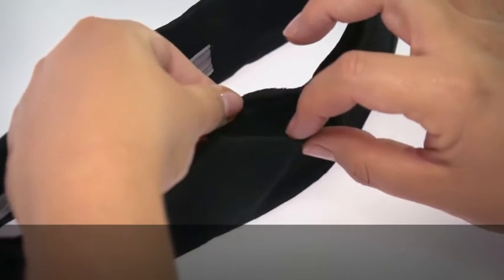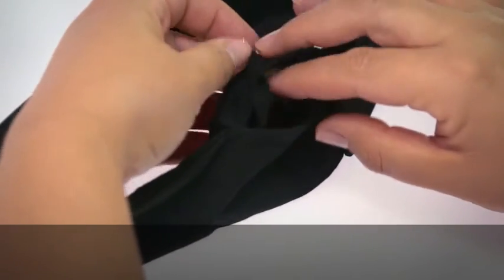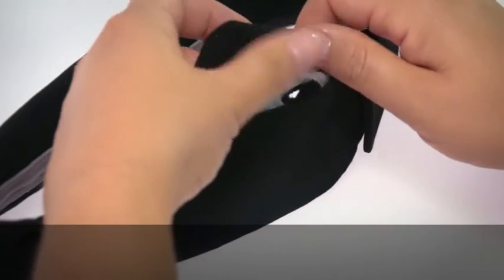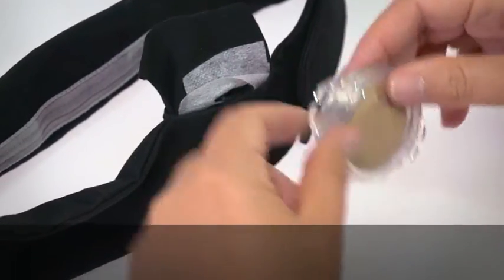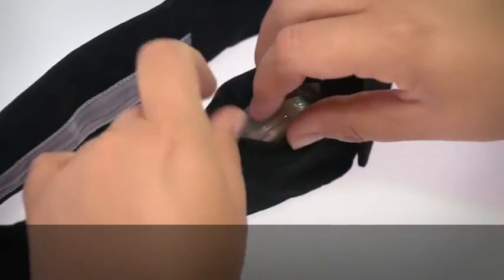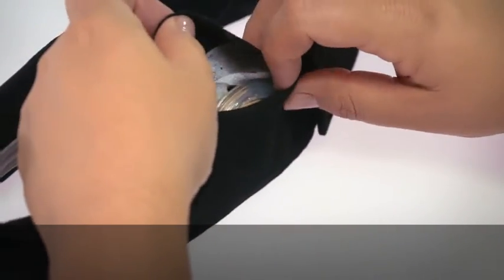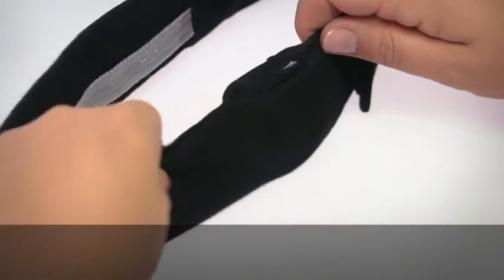Open the outer pocket and lift the inner pocket. Position the Kanso in such a way that the magnet is facing towards the inside of the headband. Secure your Kanso within the inner pocket and close the outer pocket.